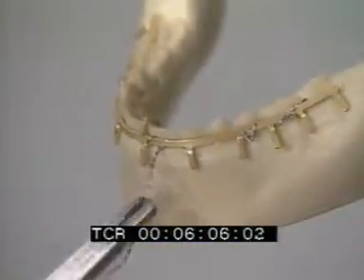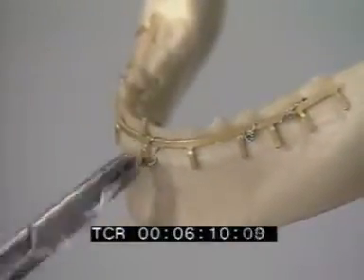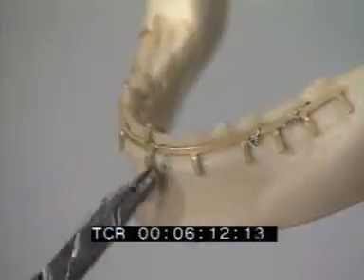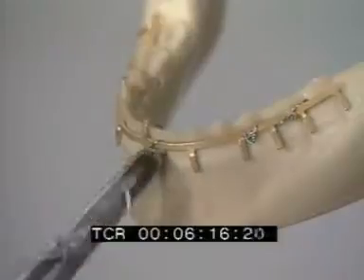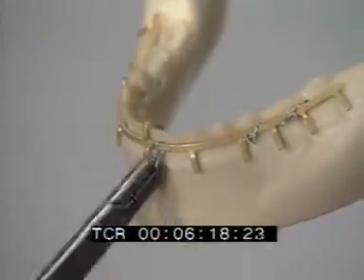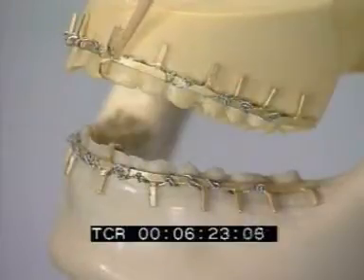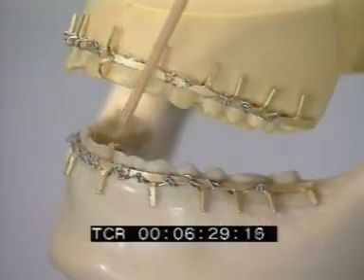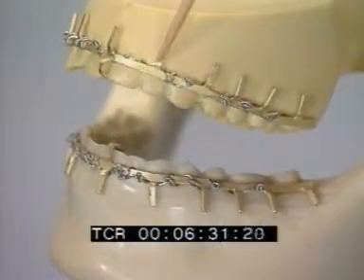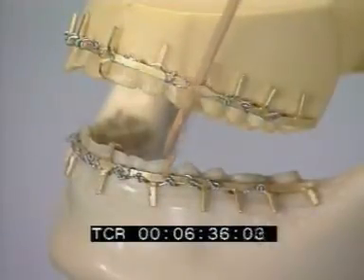With experience, the wire can be twisted off at the required position. The second arch bar is mounted in the same manner. To have calculable tension forces on both bars, the hooks must be positioned symmetrically in the upper and lower jaw. This symmetry is essential for functional training with elastics.